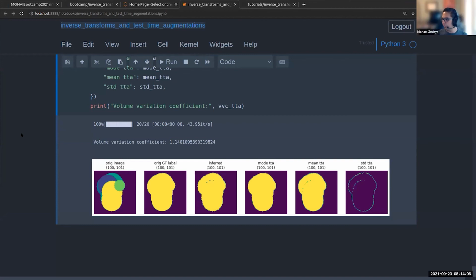Okay, and then we did have one more come in, and I think we have time for that with 2 more minutes. So, is there a method for inverting patch extraction, i.e., stitching the outputs of the model back with the appropriate averaging over overlapping voxels? No is the answer. But we do have a sliding window inference, and so that would help you to chop up your image into smaller chunks, put that through the model, then stitch it back together on the other side. So hopefully is that the use case that you're thinking of?